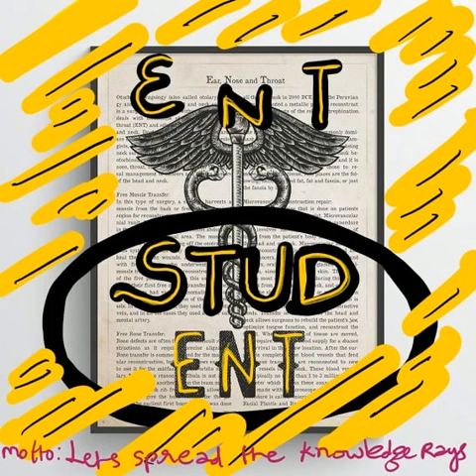This plate is penetrated in the anterosuperior quadrant to enter the antrum. The antrum is identified as a large air-containing space and continues anteriorly with the tympanic cavity through the aditus ad antrum, and posteriorly with the mastoid air cells.